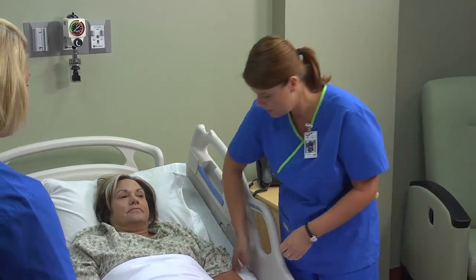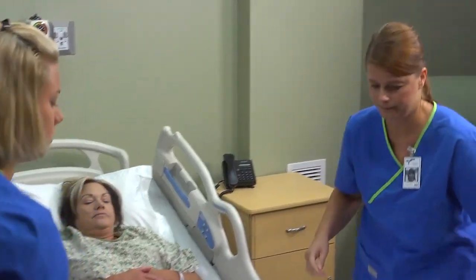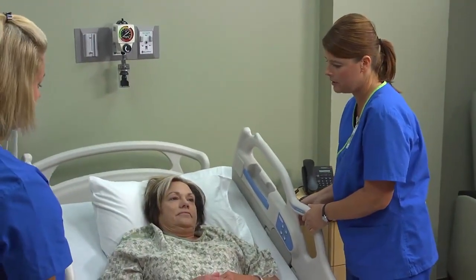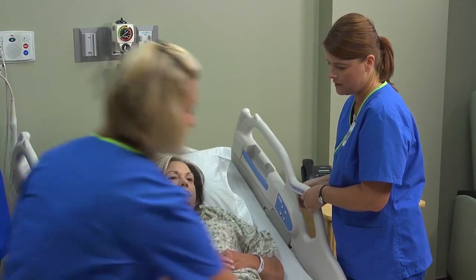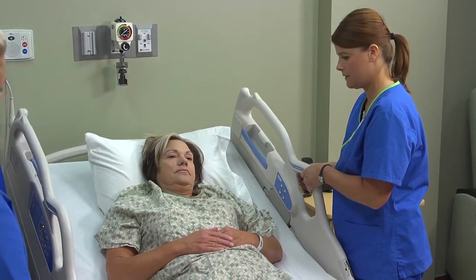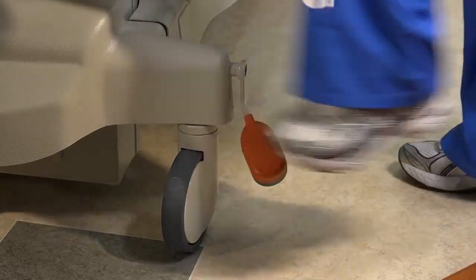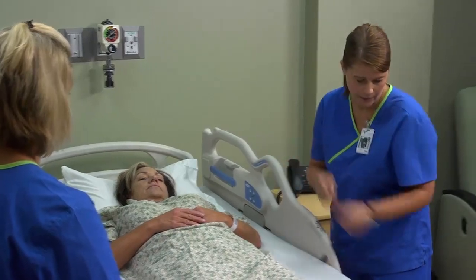To transfer a patient from a bed to a stretcher, obtain a slide board or other friction-reducing device and secure the help of 2 assistants. A third assistant may be used, if needed, to support the patient's head and neck during the transfer. Raise the bed and position 2 assistants on the side of the bed to which the patient will be turned, while you remain on the other side. Make sure the bed brakes are locked. Lower the head of the bed as much as the patient can tolerate.